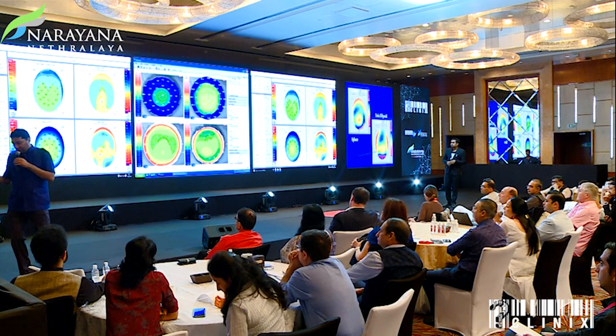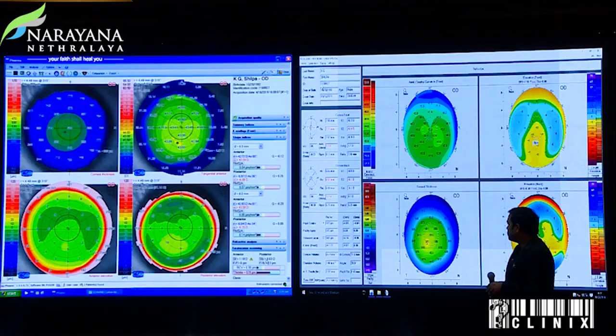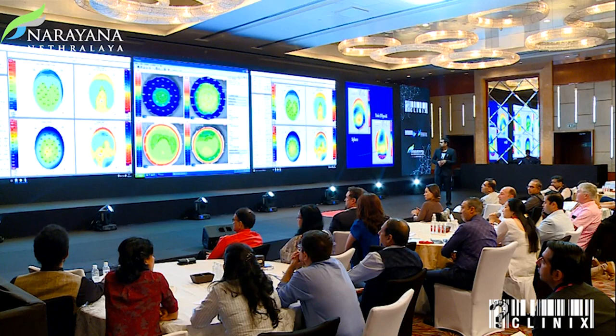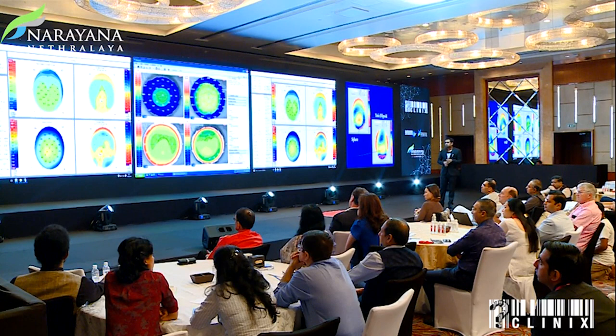Both Pentacam and Cirrus are saying the same thing — if you go to the refractive indices on Cirrus, all are well within normal limits. Looking at this, we should agree that what you see visually and what the indices show are not matching. We will probably never fully resolve this without deeper testing to understand what's really happening biomechanically.